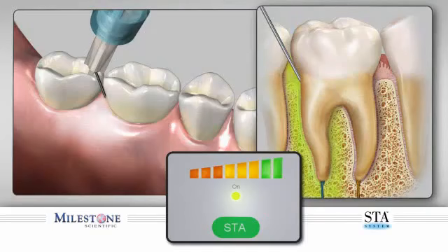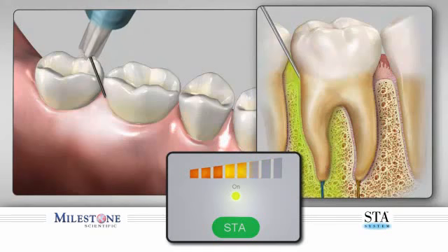After 20 to 30 seconds with the needle located in the correct location, you'll hear the STA system announce PDL, PDL. This will be followed by a series of 2 longer beeps, indicating that the proper pressure is being maintained and that you have identified the correct needle position for that injection.